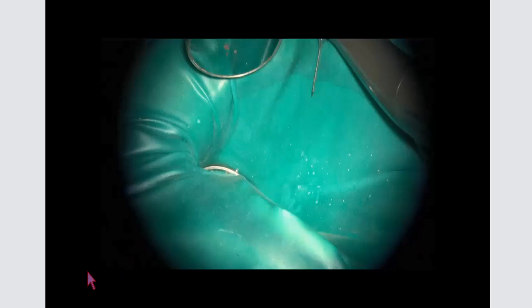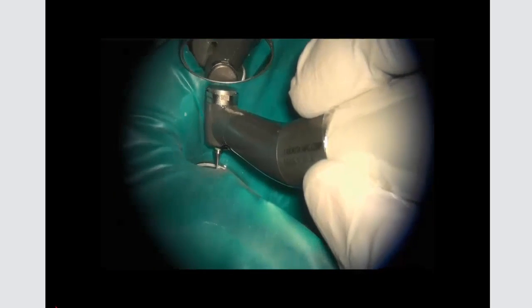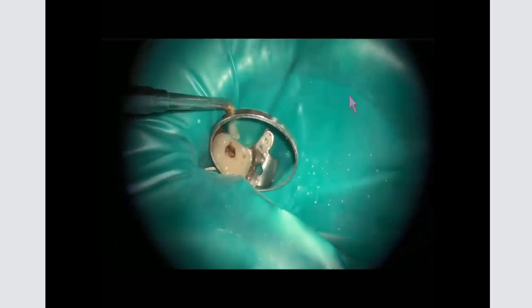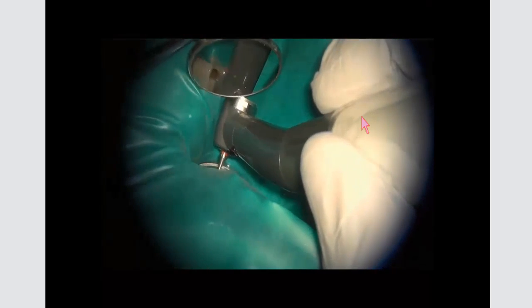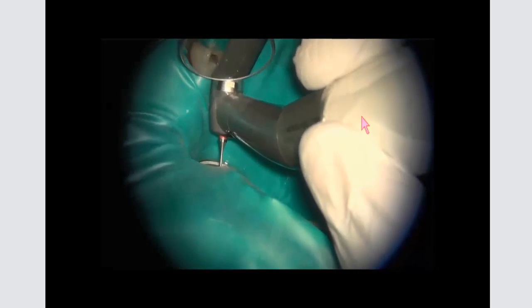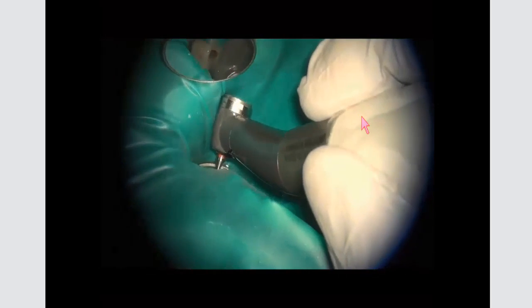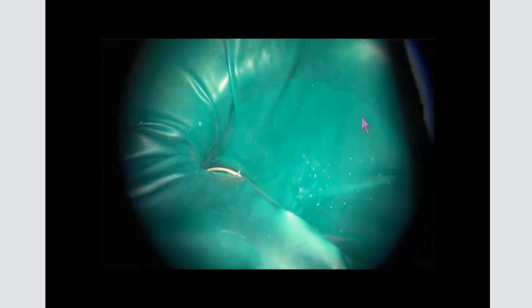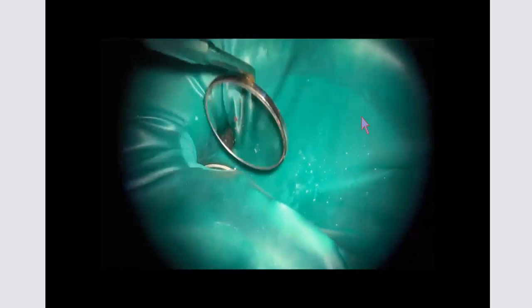Here's a video, once again, demonstrating the use of this handpiece. I'm actually, with my index finger here, pressing the button and activating the handpiece. This button is very responsive. It works like a rheostat. When I apply pressure to it, the handpiece is on. When I let up, the handpiece stops. You can also activate it by pushing it and removing your finger, and it will stay in the on position, and pushing it and releasing it to turn it off as well. But if I'm not using this handpiece in its auto mode, I'm just using it like a finger rheostat, basically.